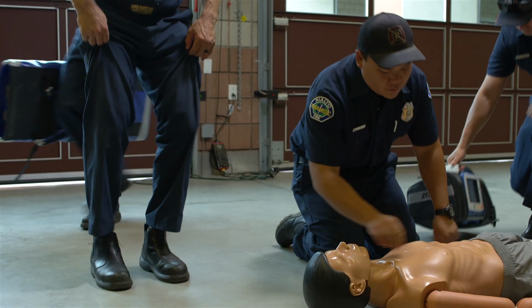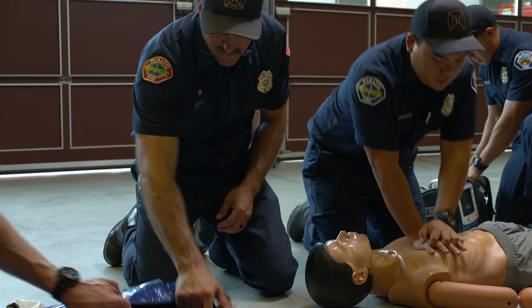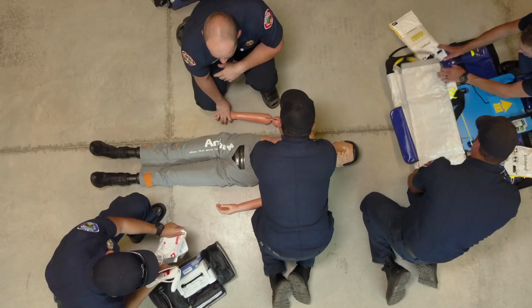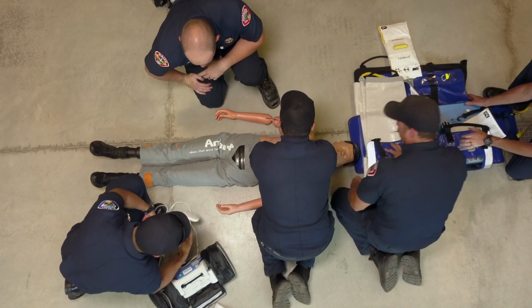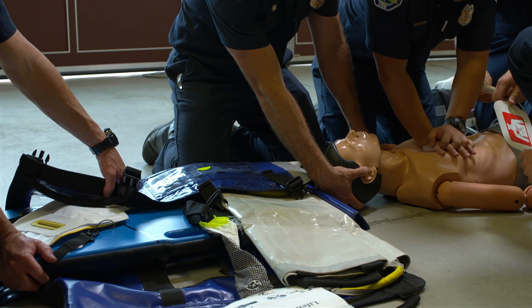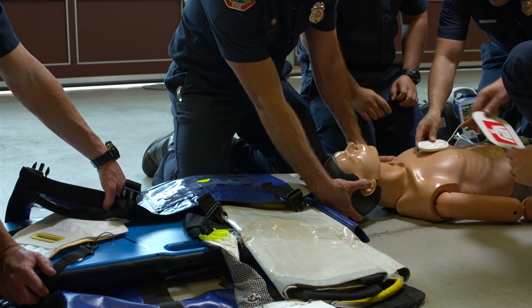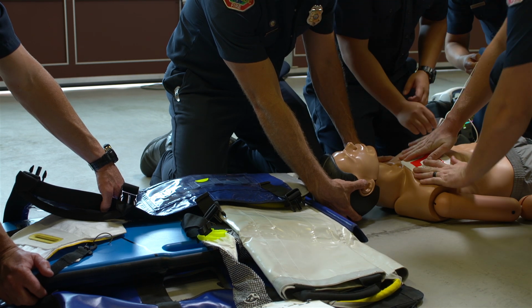See the crew come up to the patient, establish the patient is unconscious, no pulse. They will immediately begin chest compressions. You see them in the process of deploying the AutoPulse with the quick case. They'll make sure that everything's prepared appropriately with the AutoPulse, that the AutoPulse is on, that the AutoPulse band is open, the quick carry case is in the proper position.